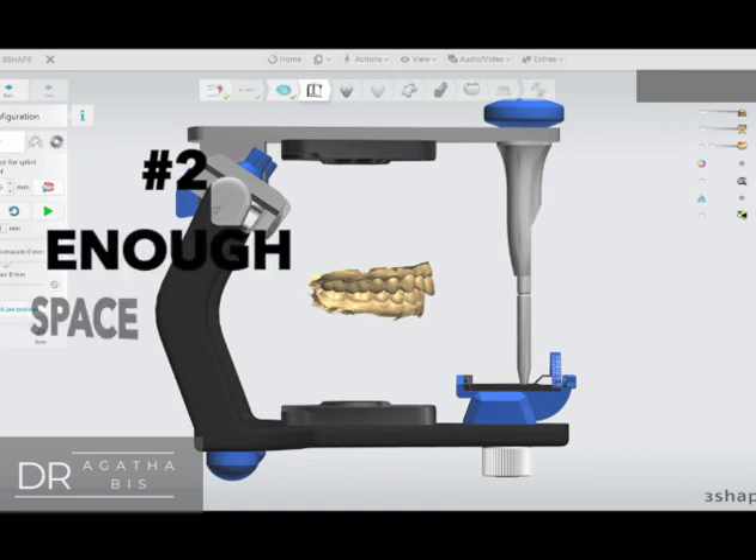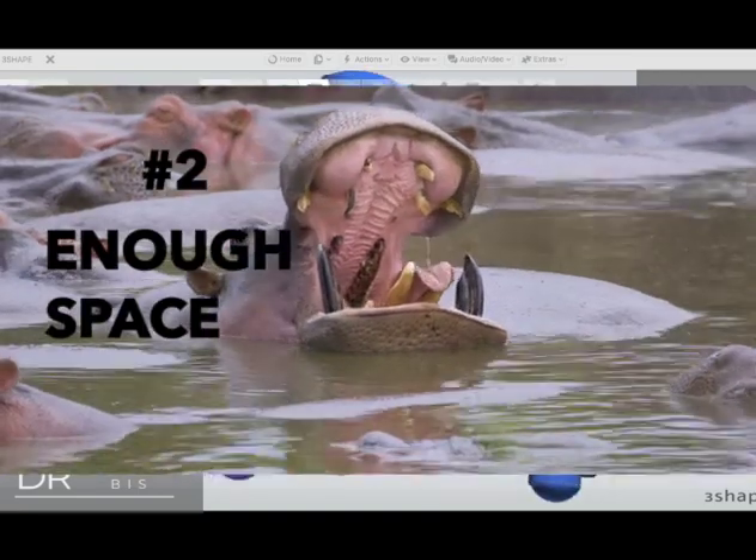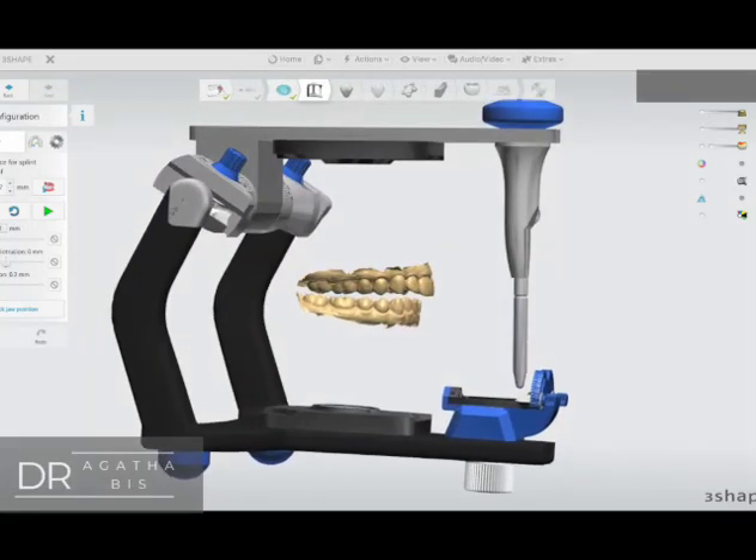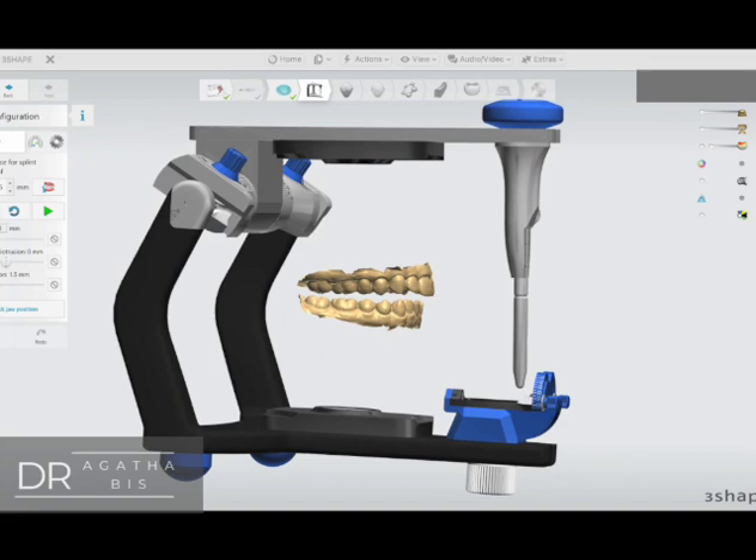Number two: open the articulator and make sure there's enough space for the acrylic of the night guard. Also make sure that in protrusive there's enough space in the anterior.